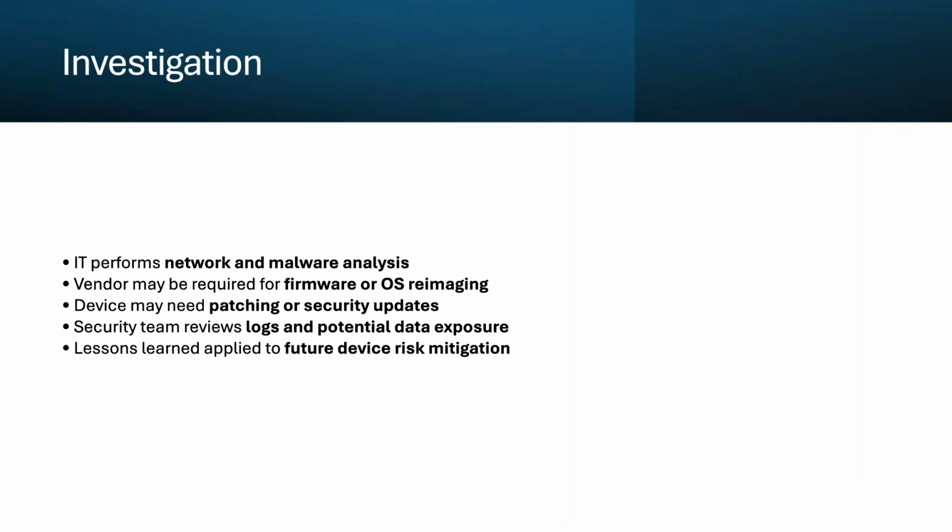The device may also need patching or security updates. Sometimes a compromise happens because the device is running outdated software with known vulnerabilities. Part of remediation is ensuring all security patches are applied if they're available.